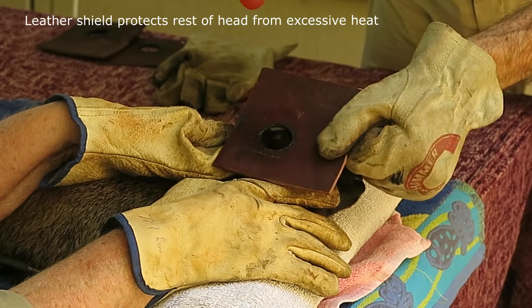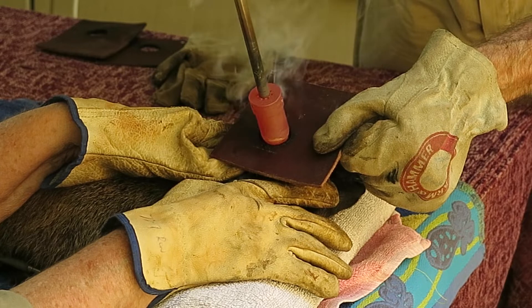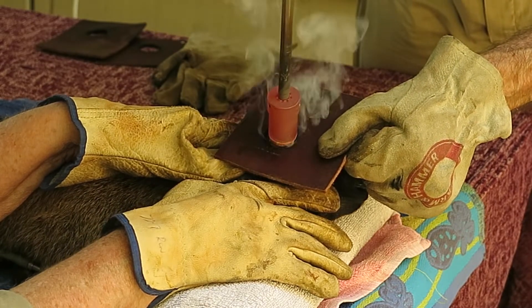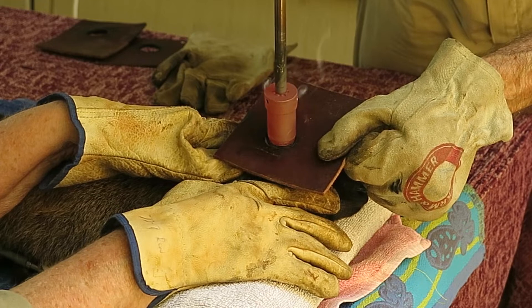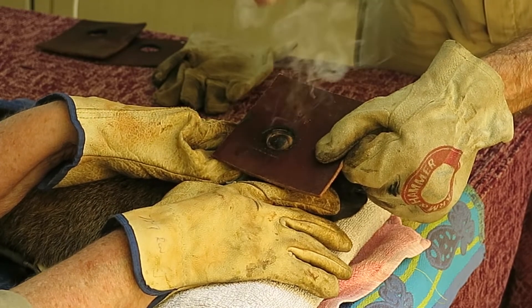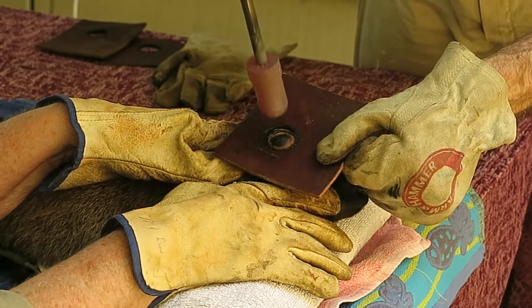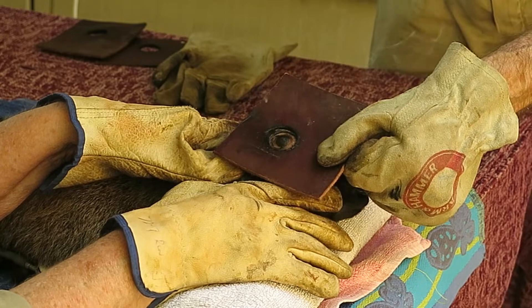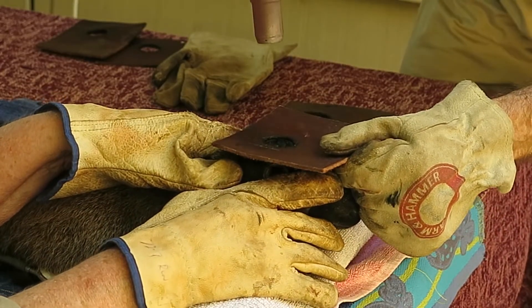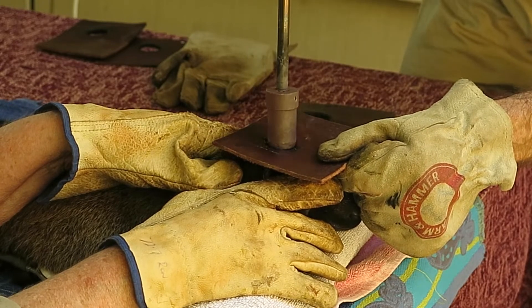We use a thick leather square to protect the other areas of the head. The iron is cherry red, so very hot. You'll see that there is a copper colour on the hornbud. Now we do the other side.